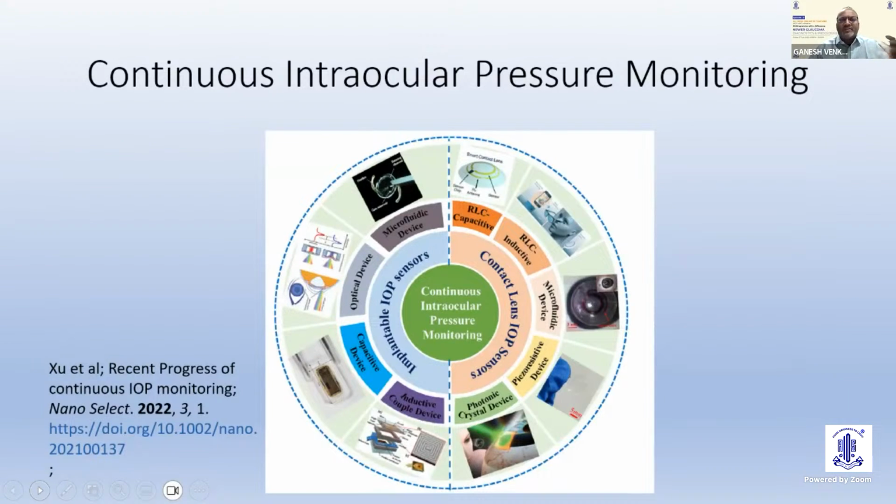Next comes continuous intraocular pressure monitoring. You have a lot of sensors which are used for these devices, and I would suggest that you look into this article, which mentions the type of sensors being used, if you want to read ahead.